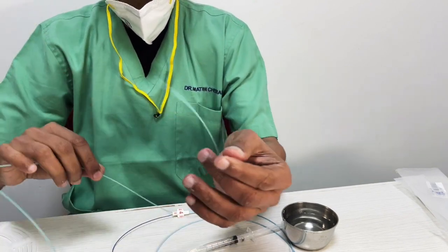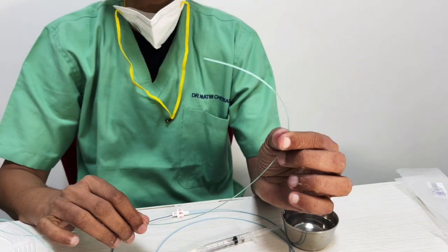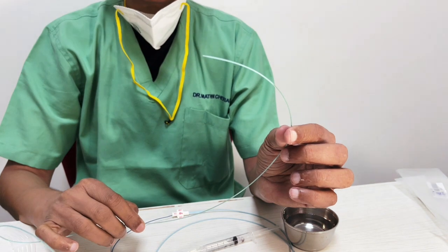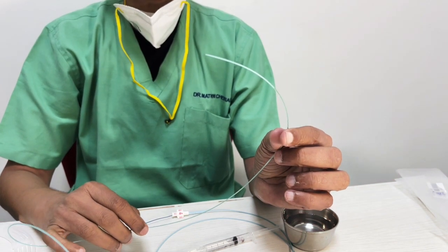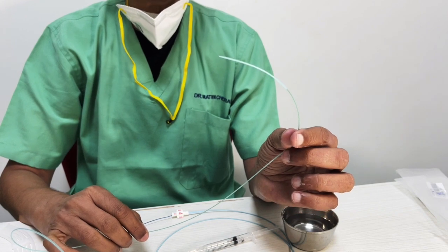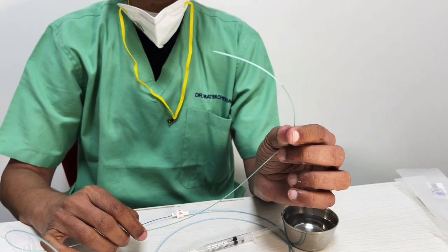All of them will have a similar thing. You need to have this tubing, without which a coil cannot become straight, and inside this you're going to push it out. So the technique is to push it through the Y connector. Once it's in the Y connector, then you will have to push it out.